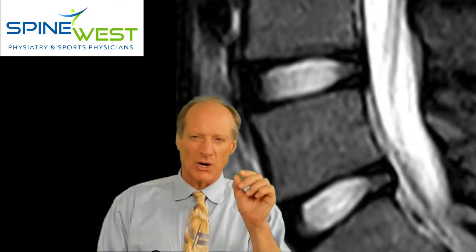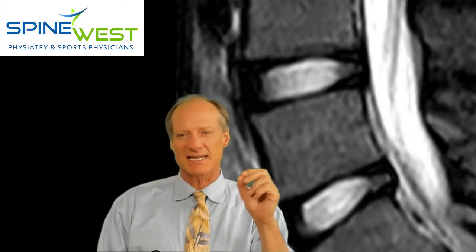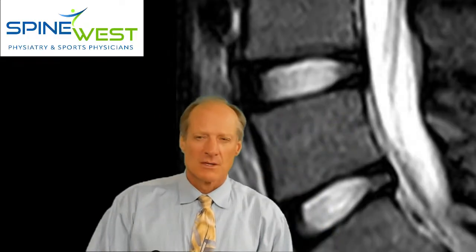The other modalities we have are bone scans, and those are radiology tracers or bone tracers that are injected into your body, and those little tracers, those radioactive tracers, will seek out actively metabolized bone, and kind of like a heat map in your house will show up as a bright blurry image.